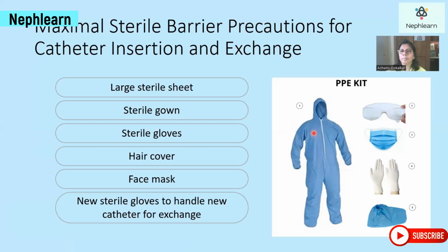So these are the barriers that we must use, or the standard precautions that we must use during catheter insertion, exchange, as well as during handling of the catheter.